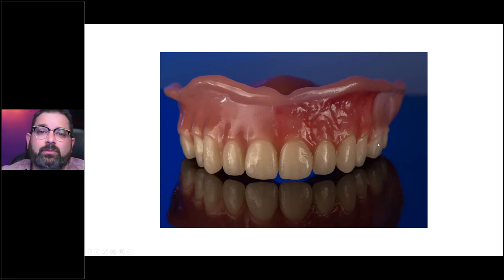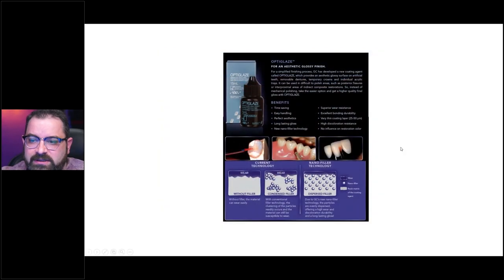You can do printed teeth or you can use stock teeth. There are many different ways of applying it. There are some limitations when using carded teeth that we can discuss another time. Now you can see that this is the other OptiGlaze I usually put on the base — the one in the black bottle. It has about 15 milliliters of material.